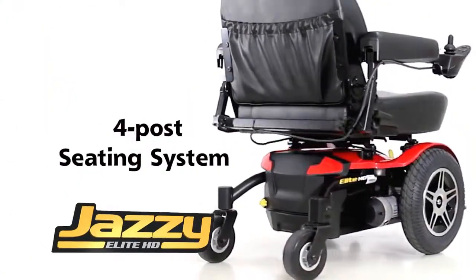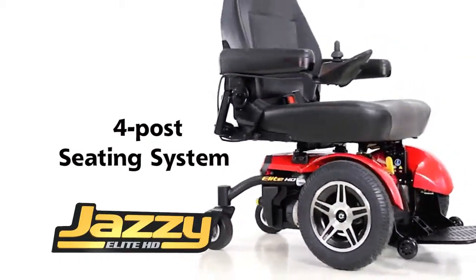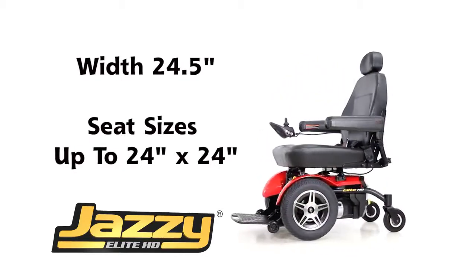This unit has been designed with a four-post seating system for increased stability and optimal positioning, featuring a width of 24.5 inches and seat sizes up to 24 inches by 24 inches.